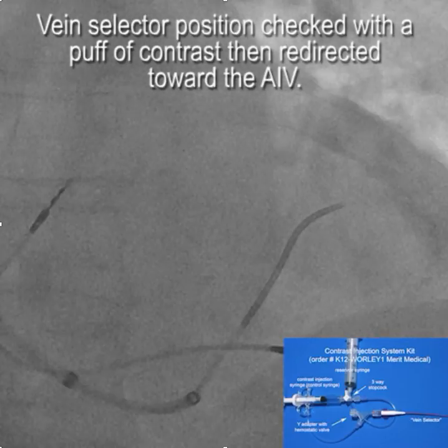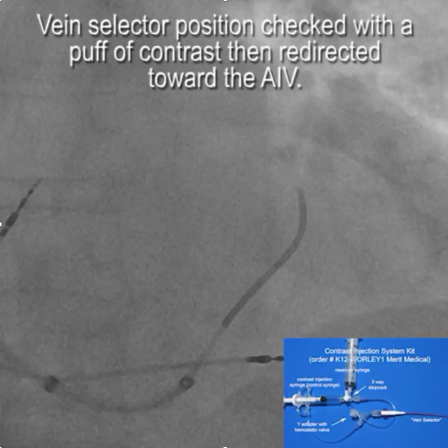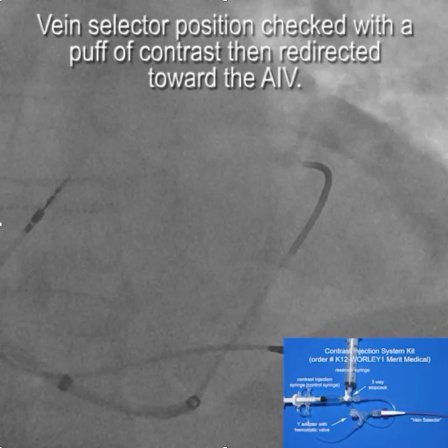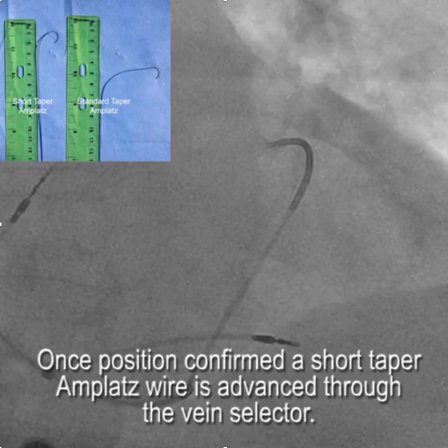We'll turn and bring the vein selector back, then torque it back towards the anterior interventricular vein and advance up into it. You're doing this carefully and watching the tip to make sure it doesn't bend. If there's any question, you just give a little puff of contrast to be sure where you are.